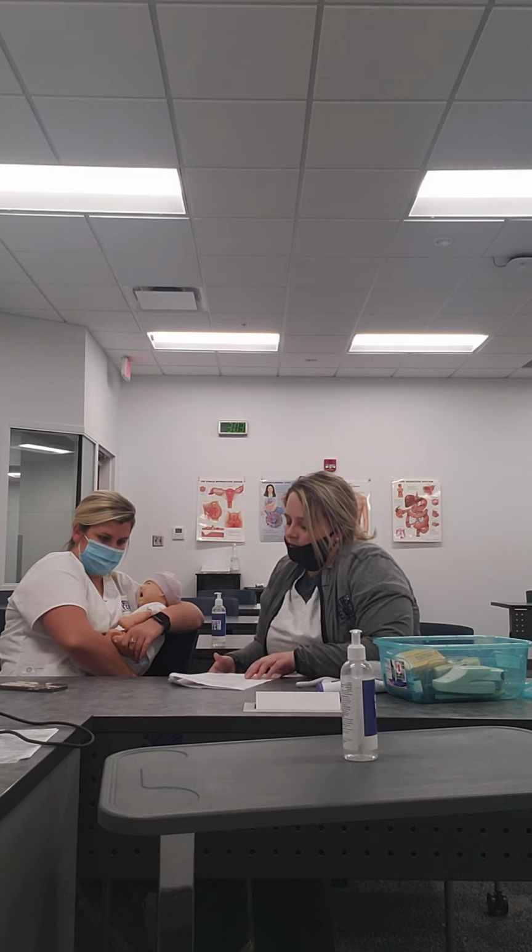While the device is reading your child's temperature, they suggest hugging your child, keeping them on the side, making sure that the thermometer stays in place and you have that good skin to skin. Okay. And then, like any other thermometer, wait for it to beep, and you have it.